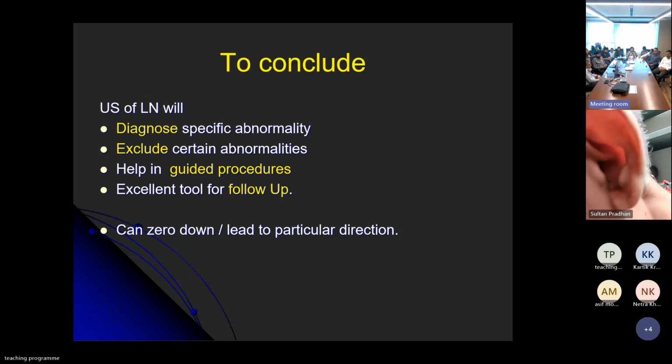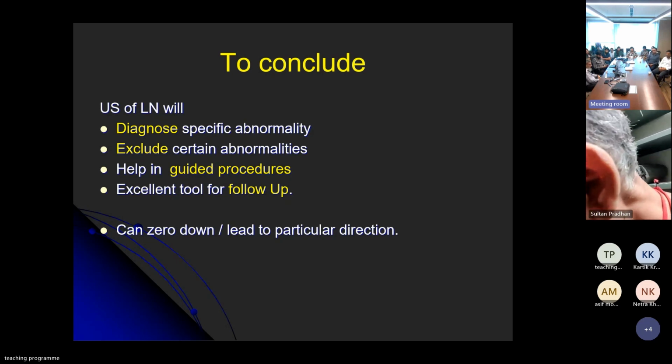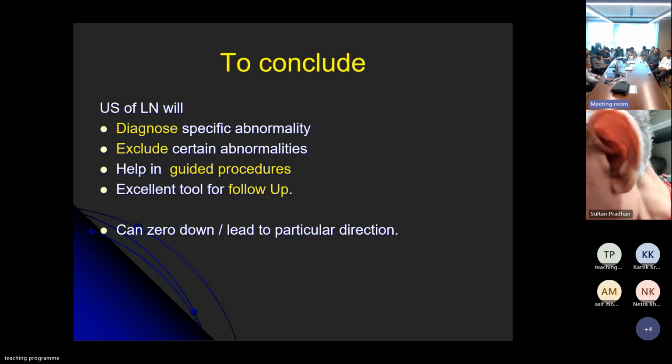No, we can use the intracavitary probe with topical anesthesia to avoid gag. It is also used for the higher carotid bifurcations in general, so the same principle can be used. Something similar is used for seeing the area behind the tonsil. The only thing is it is a little cumbersome for the patient, and you have to use some topical anesthesia.